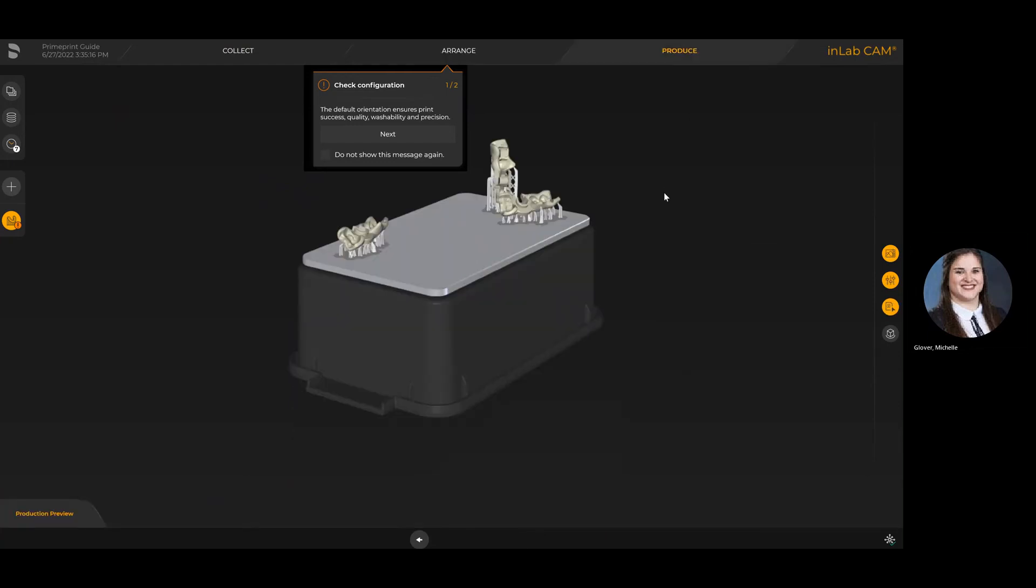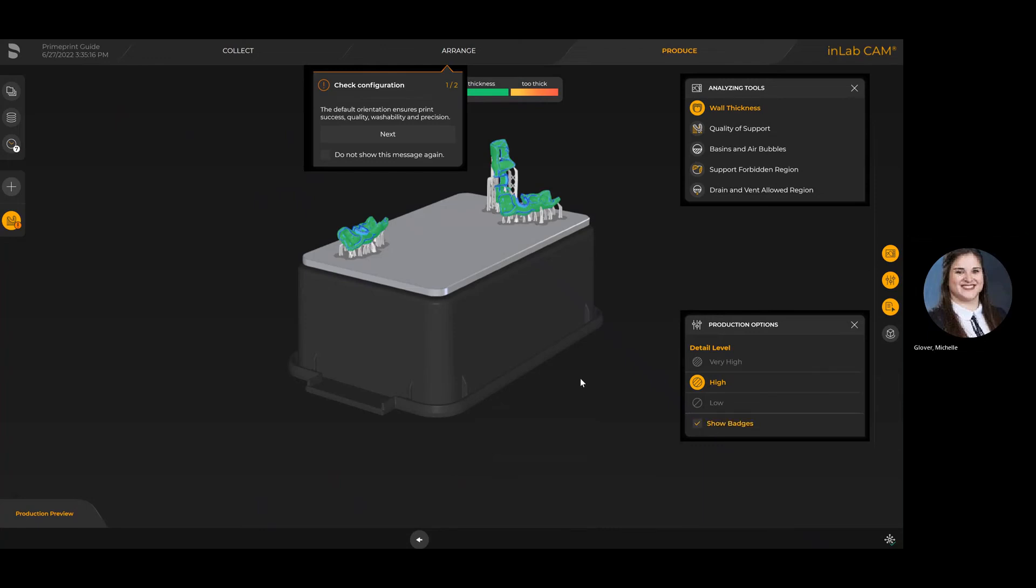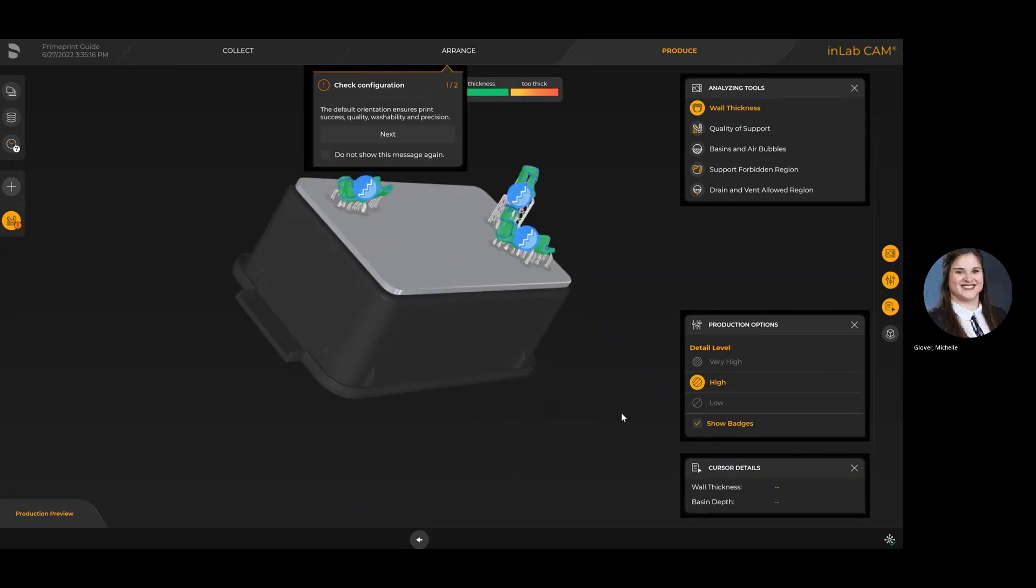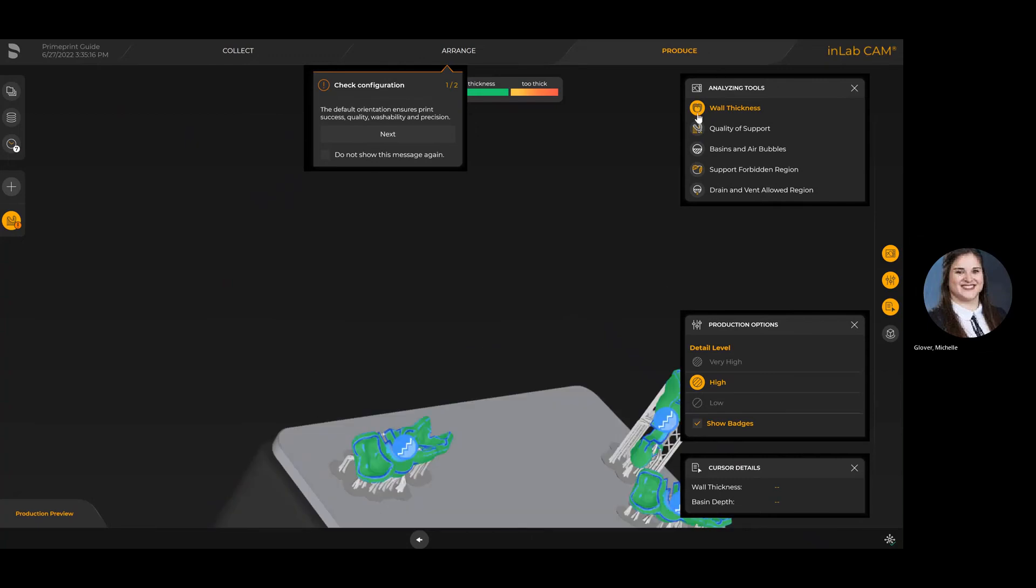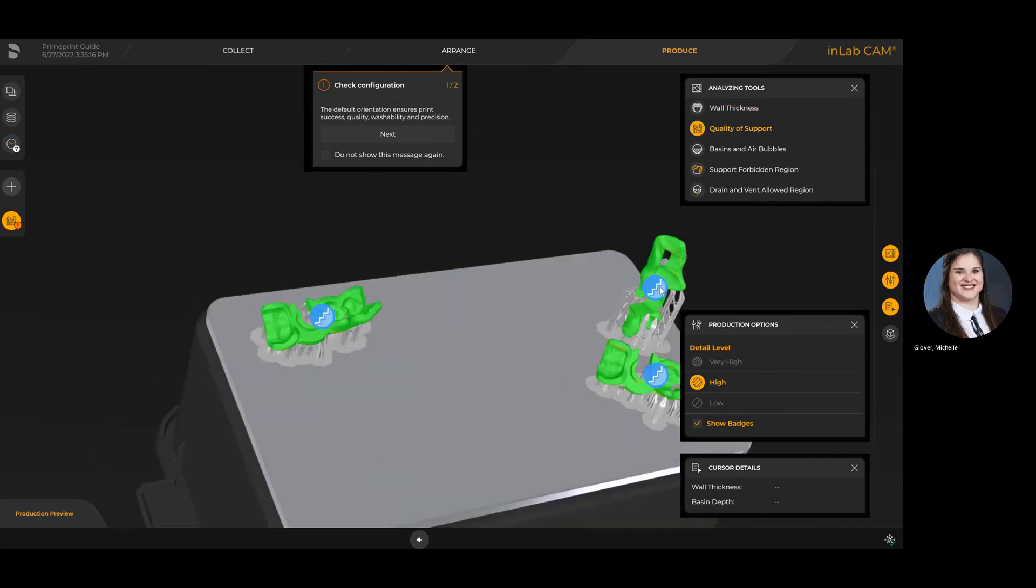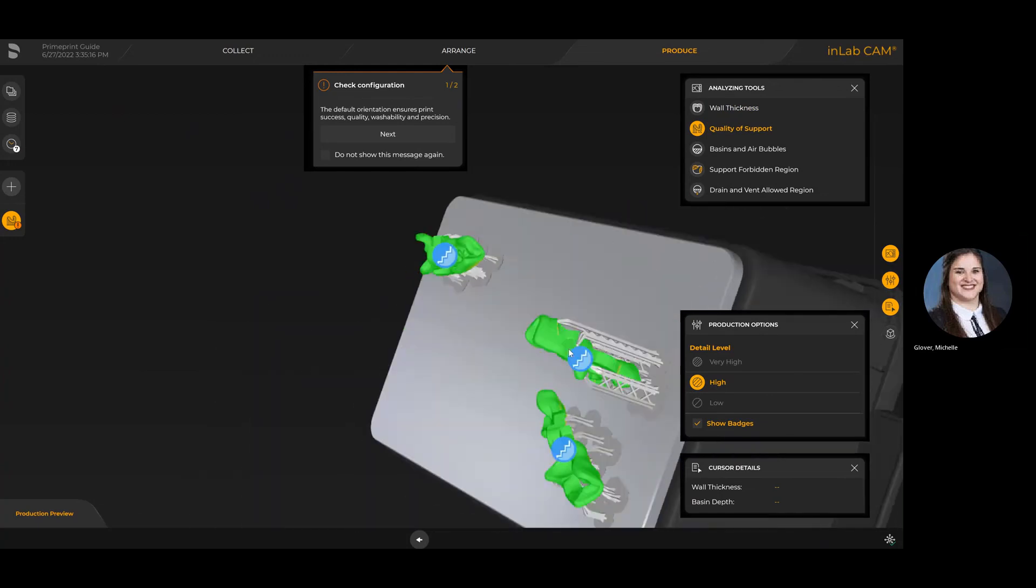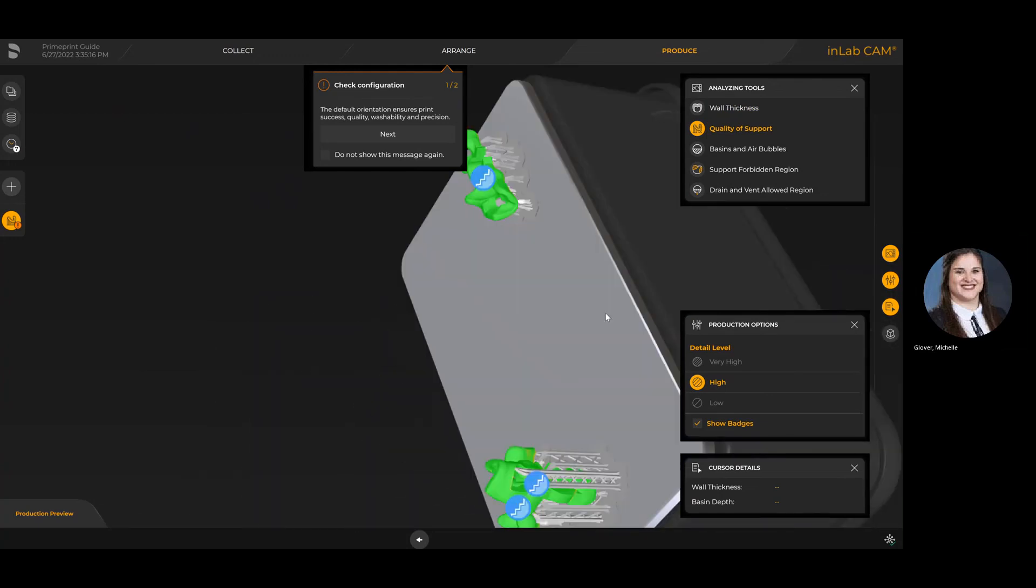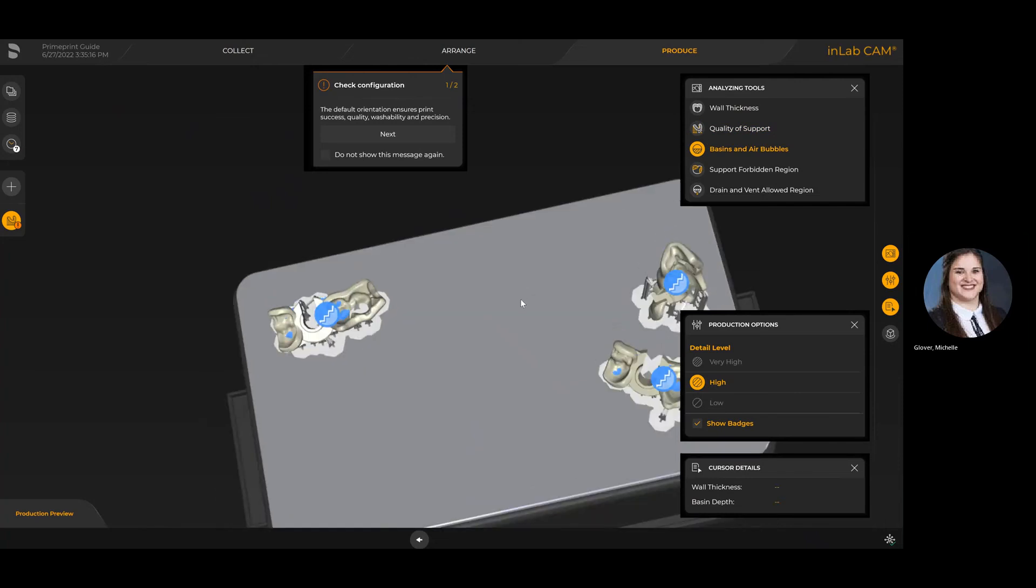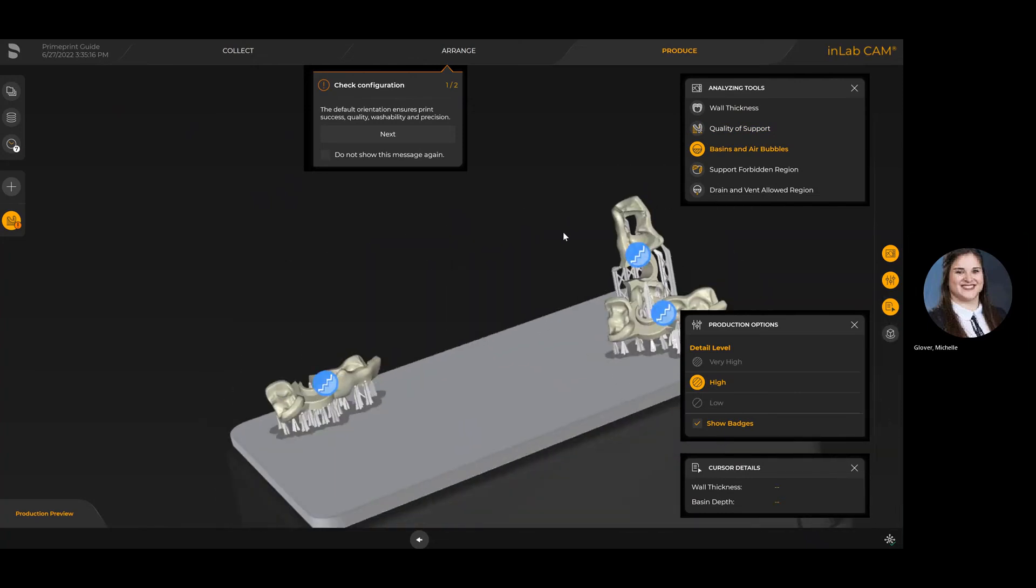I'm going to look through those analyzing tools once more so you can see the difference that it can make when changing the type of nesting. We've got wall thickness—that's more to do with the design itself, so we're seeing any thinner areas that might be of concern. Then quality of support, so we can see that based on the supports, we're getting good quality restorations or jobs. Then basins and air bubbles that will change based on how you have it nested.